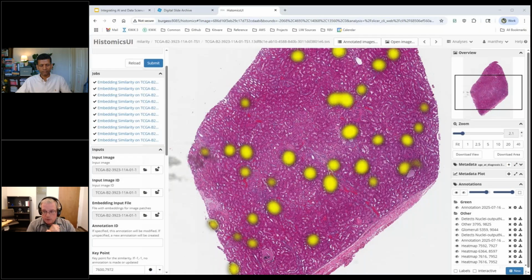And then going back to multimodal models, yes, definitely. There's another project where we had a customer integrate this, where he was using Claude to ask questions and transmitting an image of what he was looking at, to get visual answers. I tried a terrible bag of words model where I said, can you describe what you see in each patch? So I pick an area and tell me about it. And that did not do nearly as well as I was hoping for.